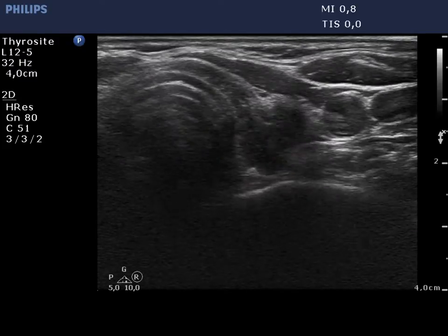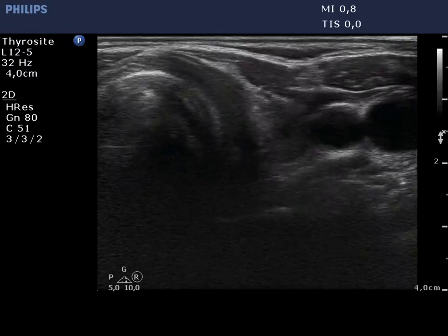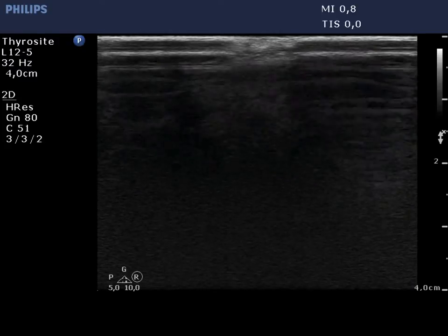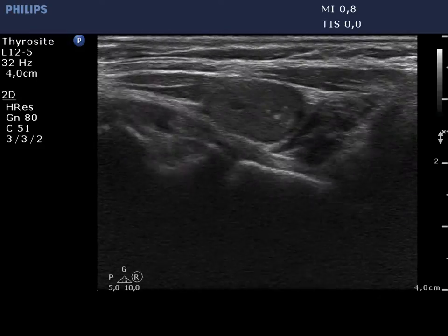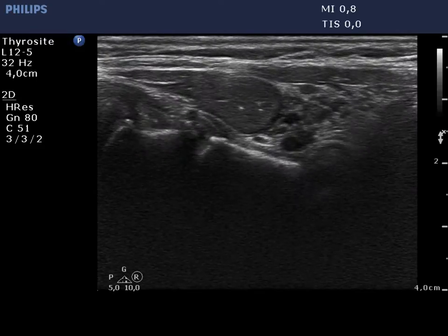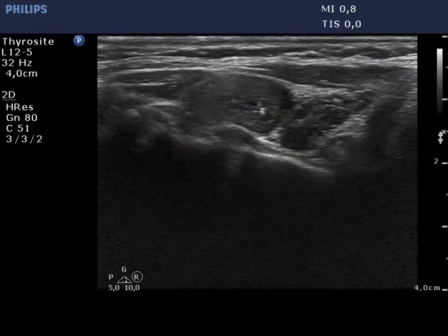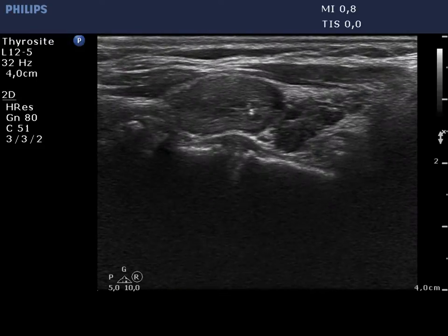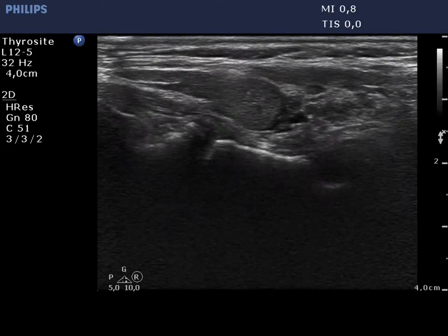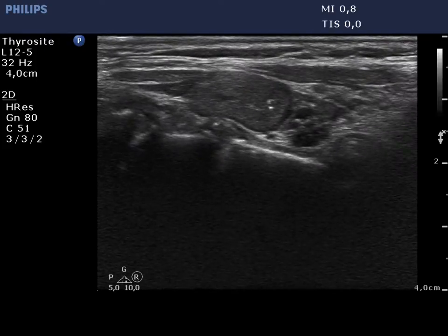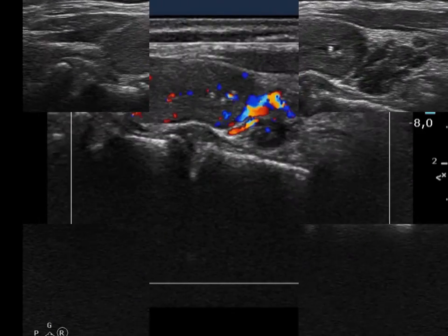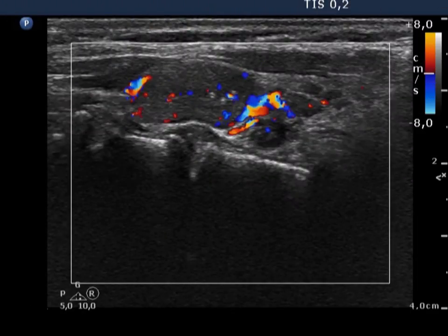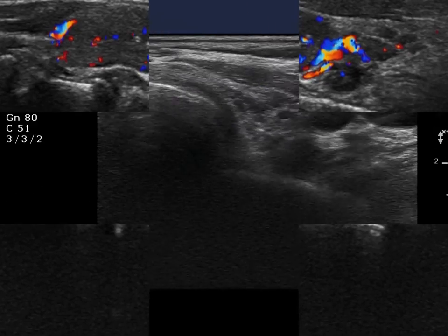The basic pattern was the same in the left lobe. However, there was a less hypoechoic and less inhomogeneous lesion without fibrotic changes in the upper part. The lesion displayed microcalcifications. The nodule presented a Type III vascular pattern.